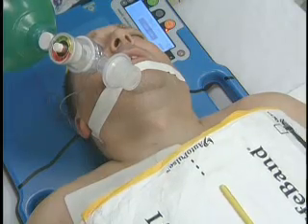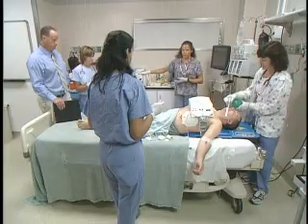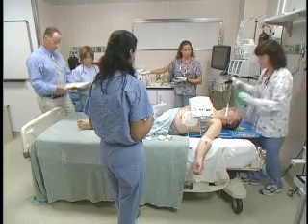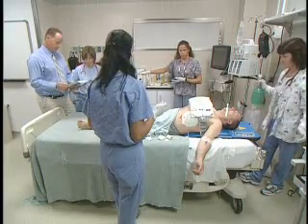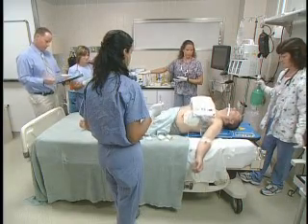Let's re-engage the auto pulse and get ready to defibrillate at 200 joules. I'm going to hold the atropine. Clear — all clear. If he stays in V-fib, I want to try amiodarone.